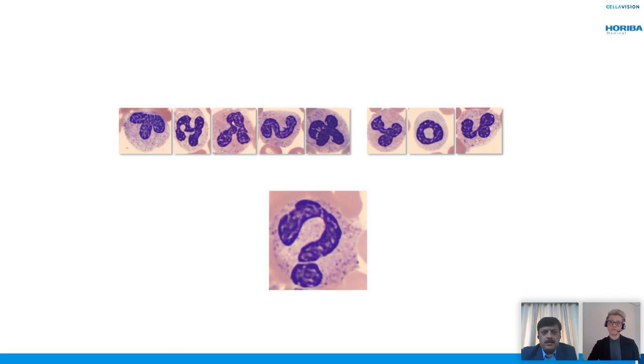Okay. Fine. Coming back on that one, it's almost similar when we are running samples on hematology systems. If you look at the ideal temperature and time within which you should run a sample on an analyzer, the reason is that you would in most probability see variations once you cross that time or that temperature. And those same variations would then reflect onto the differential once the slide is prepared, stained, and sent into the CellaVision system.